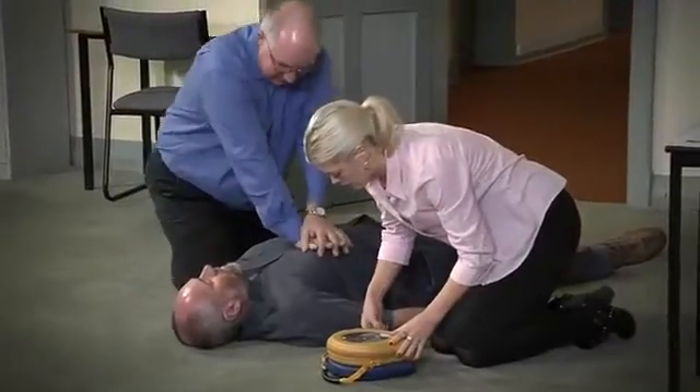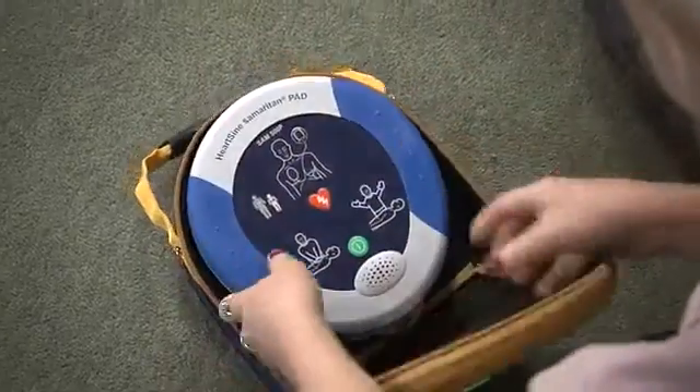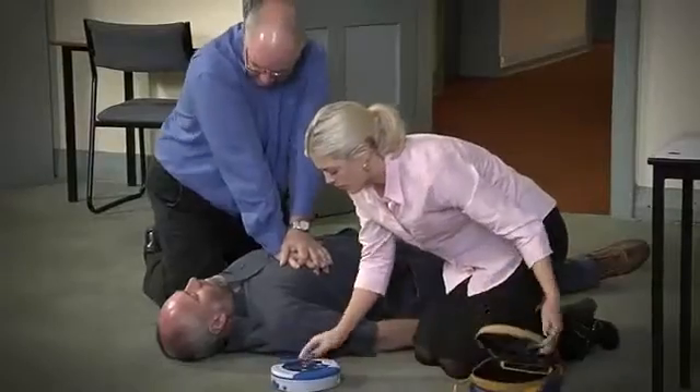Remove the AED from its carry case, switch it on, and follow the voice prompts and instructions.